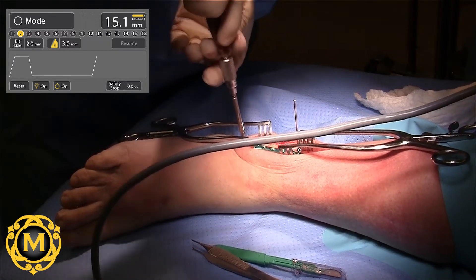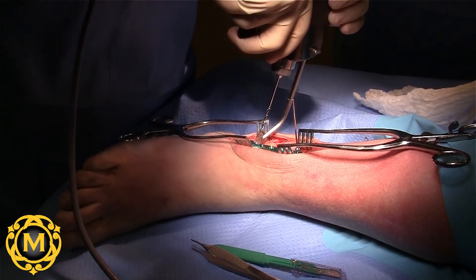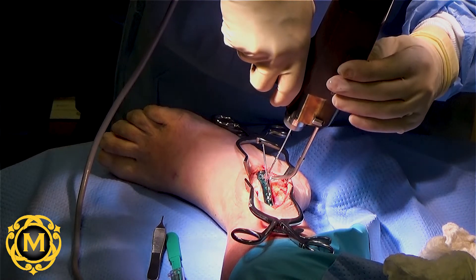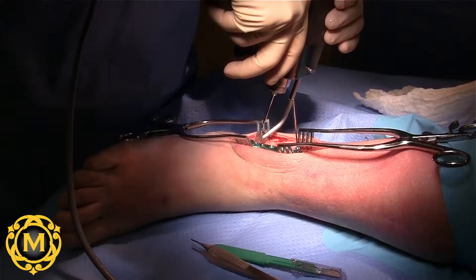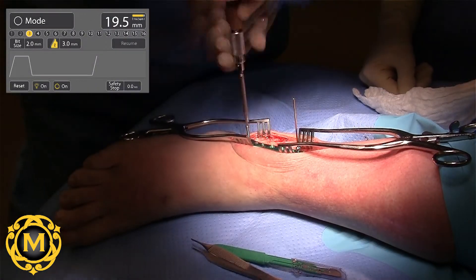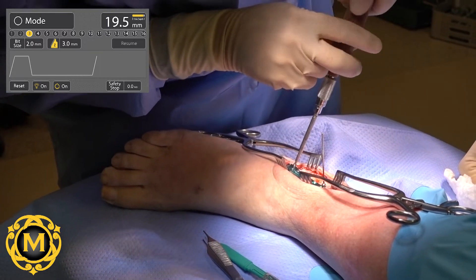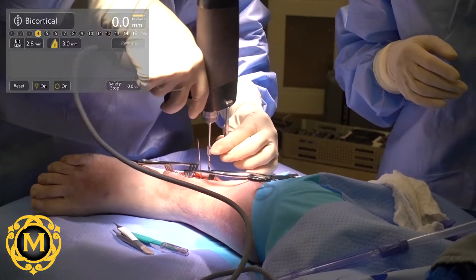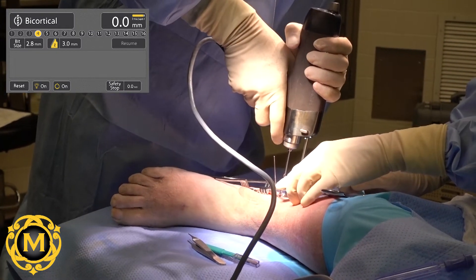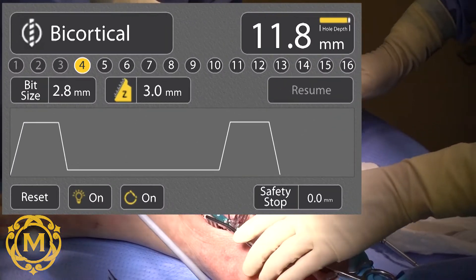Of note, current screw sizes for this hardware come in even lengths only. Using the same drill settings and IntelliSense drill technology, a third hole was drilled in the distal portion of the lateral fibula plate. The IntelliSense drill is ergonomically designed to become virtually weightless in the surgeon's hands when drilling at this angle, reducing operator fatigue. With the automatic IntelliSense measurement of 19.5 mm, the surgeon was able to forego a manual depth measurement step and immediately selected a 2.7 mm by 20 mm screw. At this point, the 2.0 mm drill bit was exchanged for a 2.8 mm drill bit for drilling of the holes in the more proximal lateral fibula plate. The IntelliSense drill bit size setting is updated on the controller, as updating this setting helps ensure the 0.6 mm drilling accuracy.